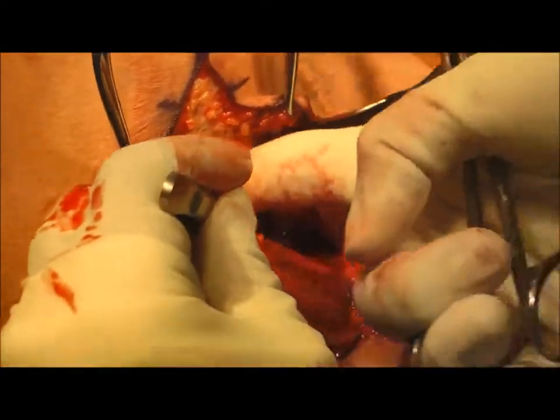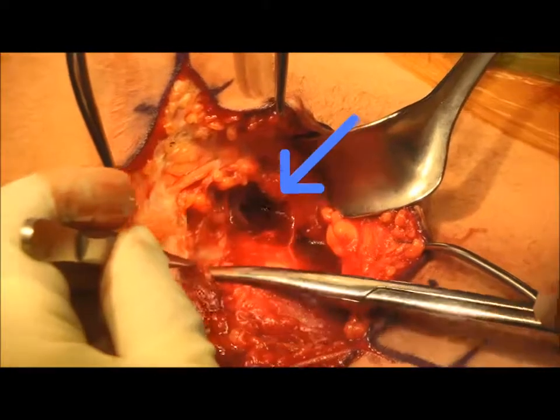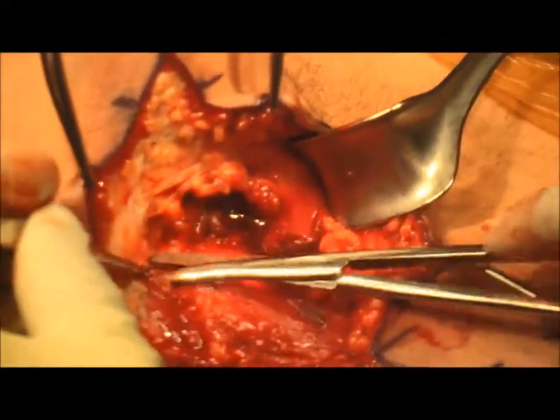As dissection continues, we are getting closer to identifying the tendon, as we encounter its seroma cavity and we see the seroma fluid accumulating.